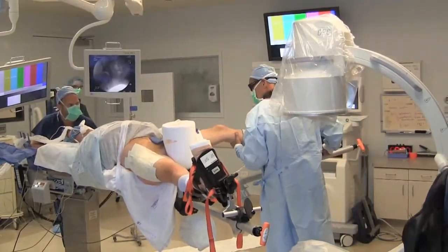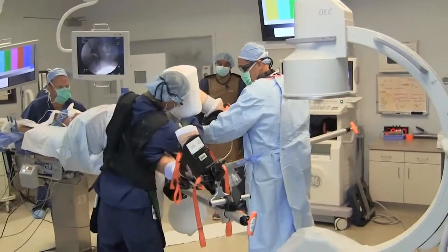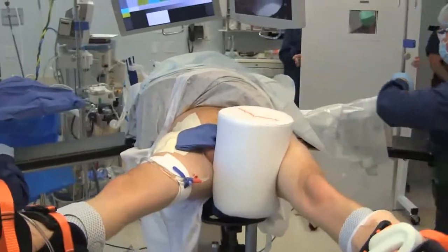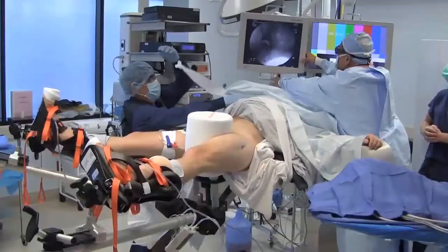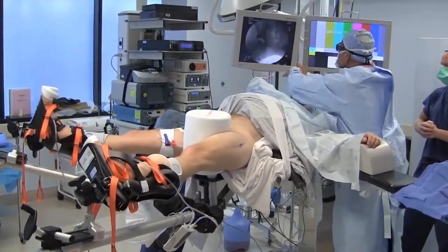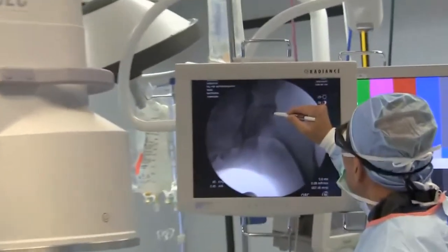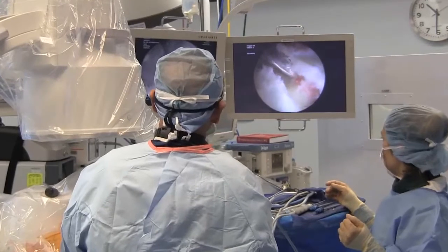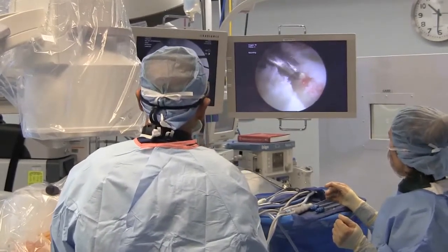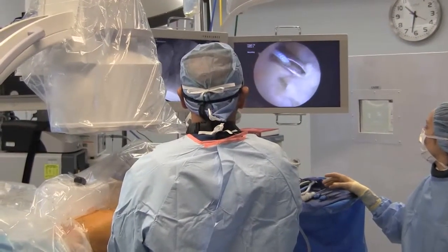We prefer to redrape the patient, and placing the operative leg in a frog leg position facilitates moving the groin post towards the operative hip. The lower extremities and floating monitors are then repositioned into mirror images of that used for the first hip. The C-arm device is rapidly deployed from the position between the legs, and contralateral hip arthroscopy is performed via small capsulotomy with attention to traction limited to central compartment work as well as during labral suture passage.